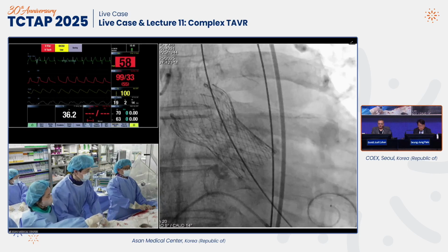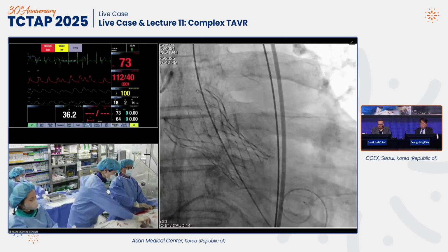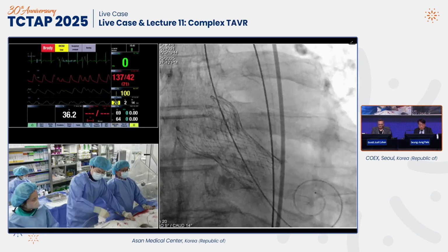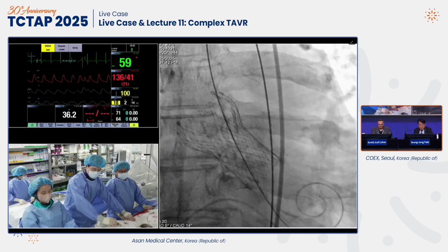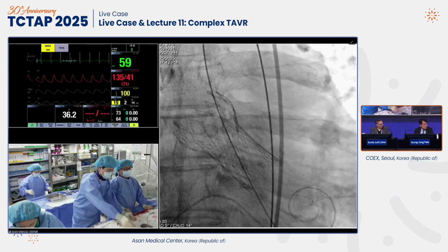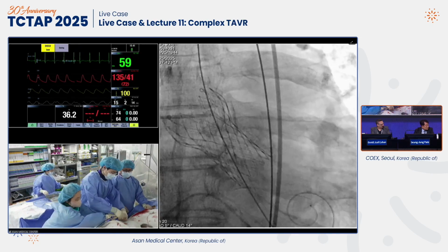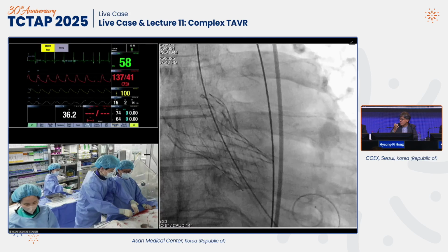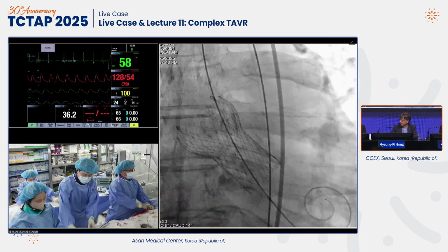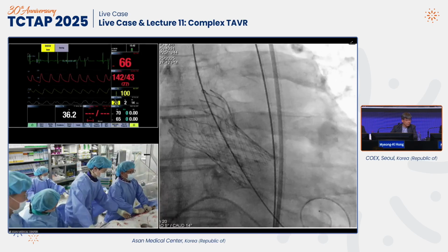And the purpose of doing the predilation is largely to facilitate the TAVR valve crossing? Yeah, facilitate. The wire itself is very difficult to cross, so definitely we need the predilatation. And the second reason is that the pressure gradient is usually more than 100, and when we deploy the valve, there is a chance of valve migration. So you'd like to predilate for that as well? Makes sense.